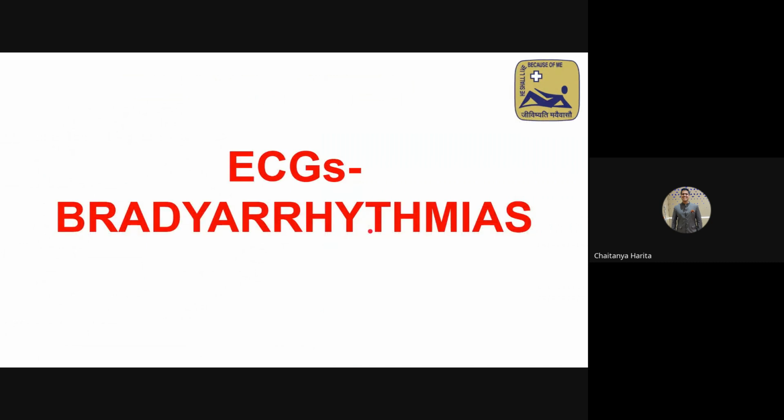Okay. So that is about tachyarrhythmias. I have oversimplified it. That algorithm and that table, I will modify the QRS, that mistake that I made, and I'll send you these slides. Just keep screenshots of that particular algorithm. You guys will never miss arrhythmias again.